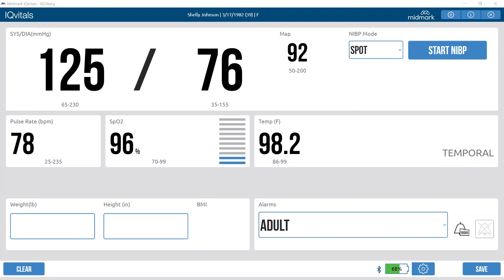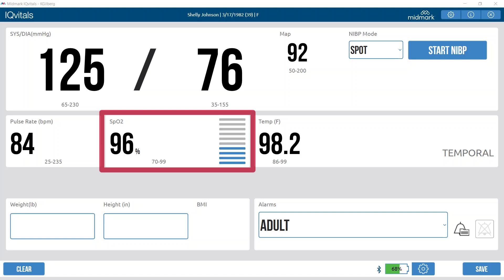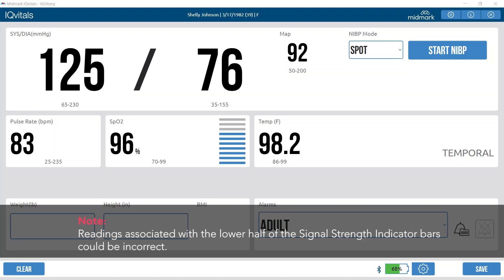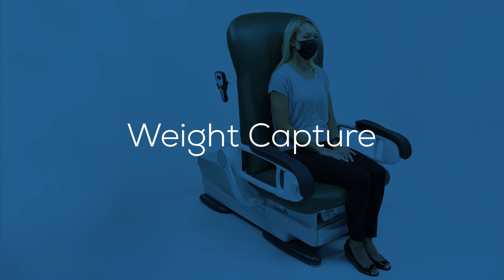The default settings display the SpO2 percentage and 10 perfusion index bar segments. When the SpO2 measurement is complete, the SpO2 value will appear and continues to update as long as the sensor is on the patient's finger. The signal strength indicator will show if the SpO2 signal is strong enough; if the signal is not strong enough, the display values are potentially incorrect.